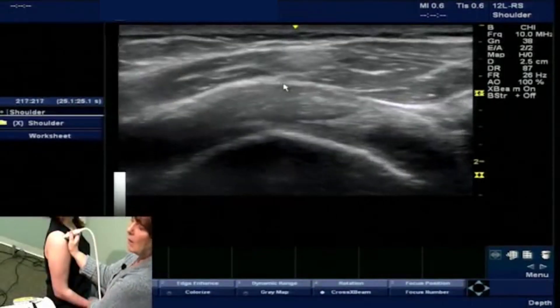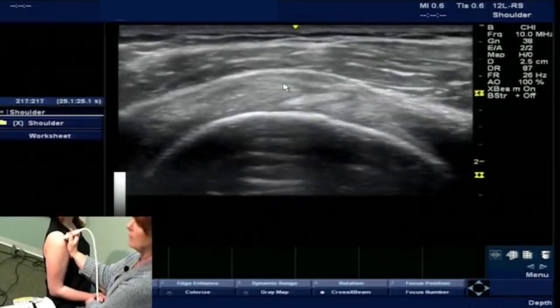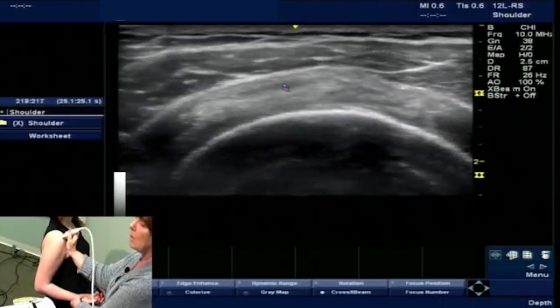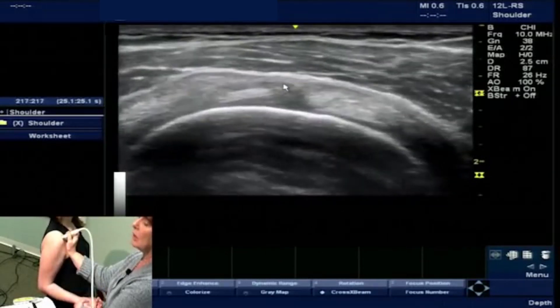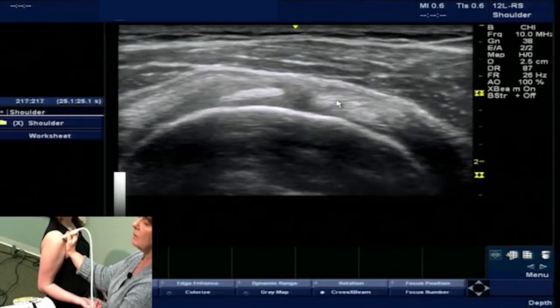In order to visualize the rotator cuff interval, we want the palm turned up and the elbow flexed to 90 degrees. We're going to shift the elbow posterior and externally rotate the arm, which will bring the subscapularis into view.